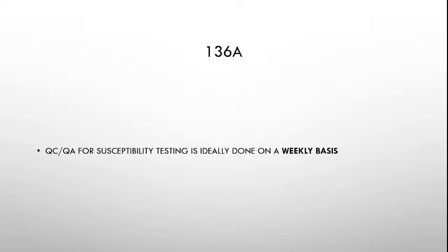This is usually the size of, like, a Pringles cup. Ilan lang ang pwede mong ilagay na antibiotics diyan, 'di ba? And then kailangan may proper spacing pa siya. So imagine, one patient will have how many plates? If you're really good at setting or plotting your antibiotic discs, you could probably put 6 in a petri dish the size of this one. If your hospital is good enough, the size of this plate would be the largest that you'll receive.